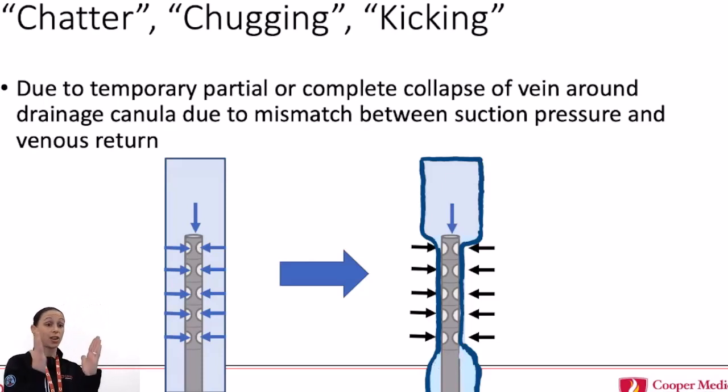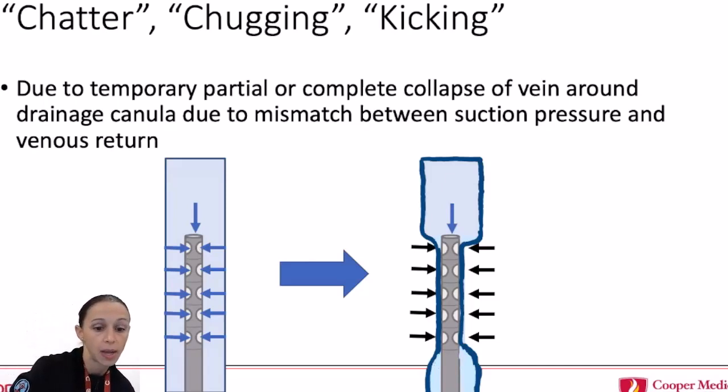Now, if this gets severe and you're in a situation where it completely collapses down, that pump is still rotating at those RPMs, and it can actually create such negative pressure that something called cavitation can occur. Cavitation is when you can draw, under such negative pressure, gas out of solution. So we obviously have gas dissolved. That's what we're measuring on a blood gas, right? So you can pull oxygen and carbon dioxide out of solution and actually create little air emboli. So this can also damage red blood cells. It can cause hemolysis. So this can be a dangerous thing.